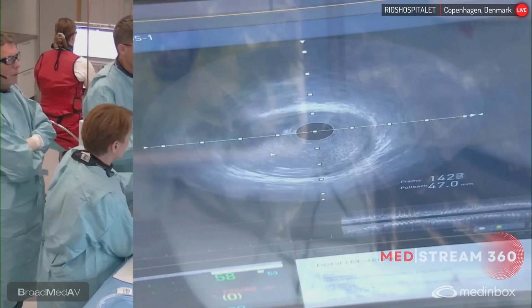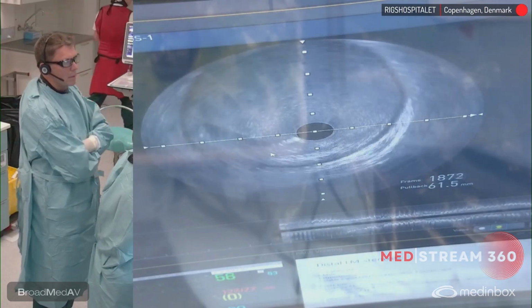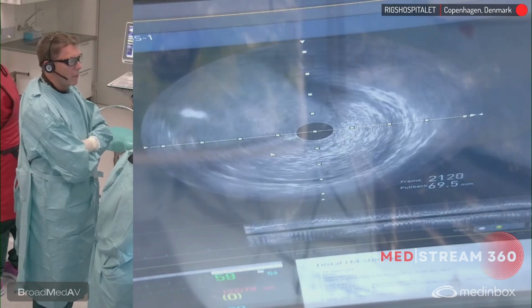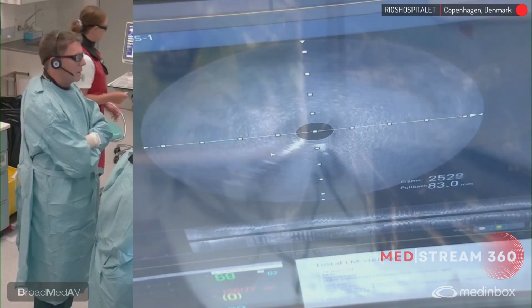Yeah, normal vessel wall, huge side branch coming. That's the second diag coming in at 12 o'clock. And here the first diag coming in. And here we see definitely quite a lot of plaque. And now we're entering the left main, and the wire from the circ coming in there, and plaque in the left main as well. And now we're in the aorta.